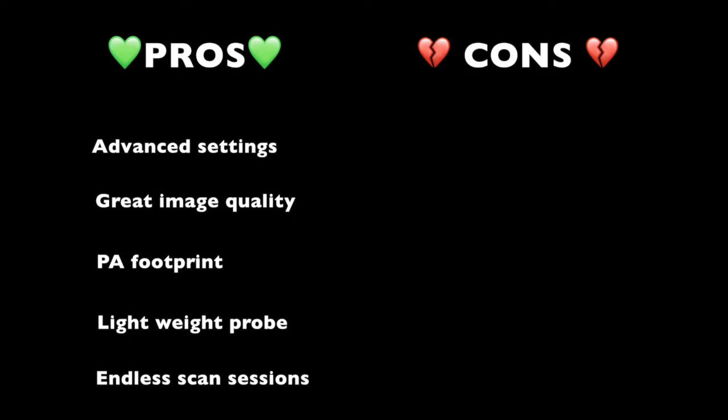To sum up, let's put the pros and cons together. On the pros column: number one, several advanced settings — in my humble opinion something unique that differentiates this device over other handheld ones. Cardiology specialists will be able to adjust the time gain compensation, the PRF, the wall filter on pulse wave Doppler, and many others. Number two, great image quality. Number three, phased array footprint and lightweight probe avoiding hand numbness on prolonged scan times. Number four, almost endless scan sessions, being able to use it while charging.